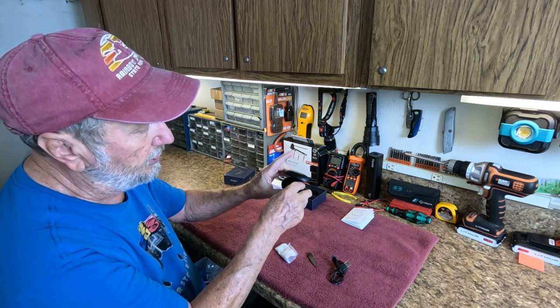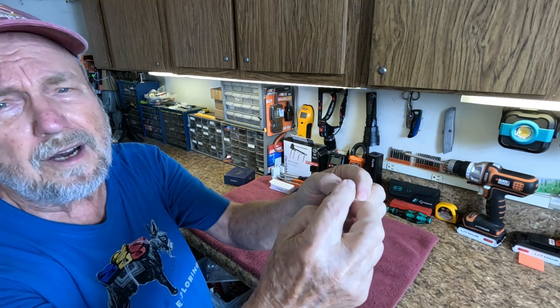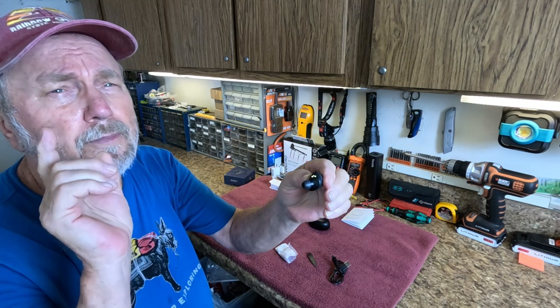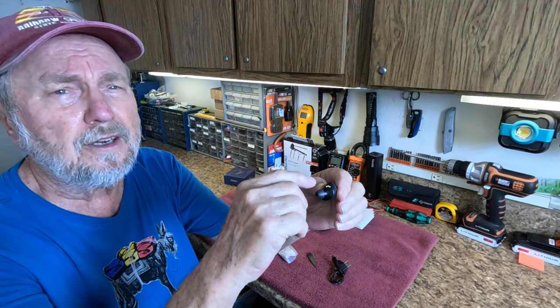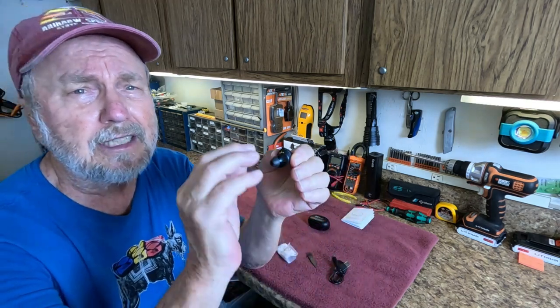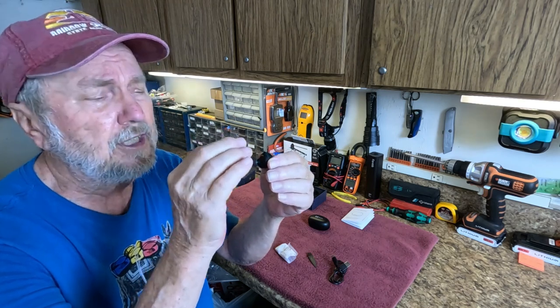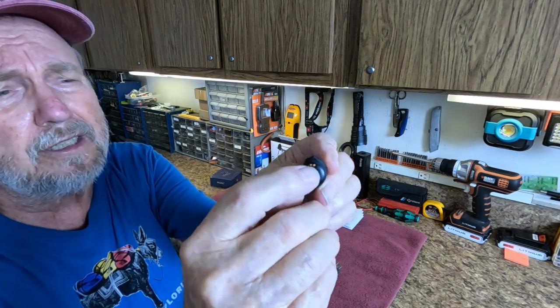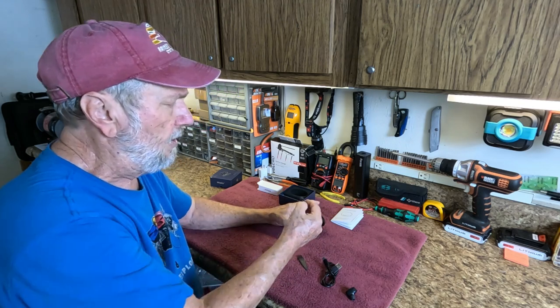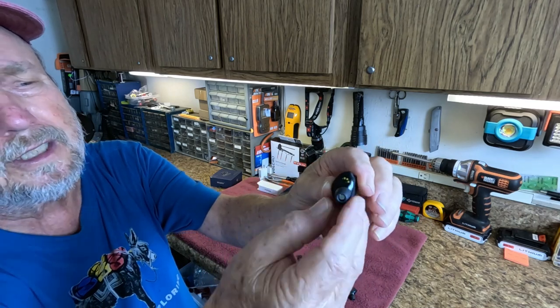The hearing aids are marked right and left on each one. There are three gold contacts on each one. When you receive this, there's going to be a little greenish or bluish cover with a tab - you have to peel that off. Look very closely because one of them may have another cover underneath. I discovered by looking closely at those contacts that there was a reflection and it was another piece of cellophane. It should be completely clear of any material over those contacts.